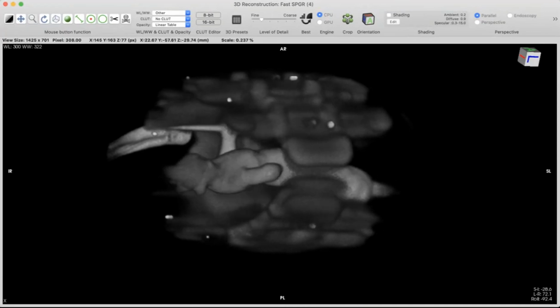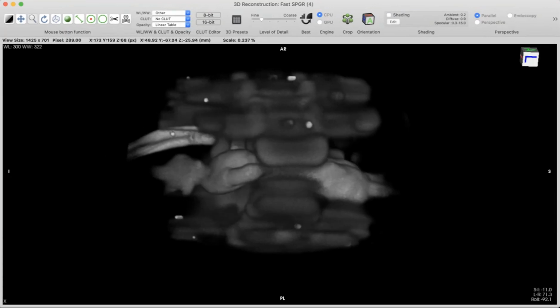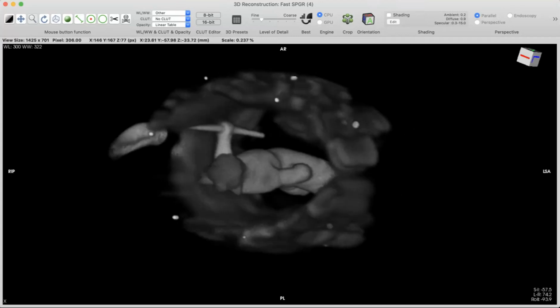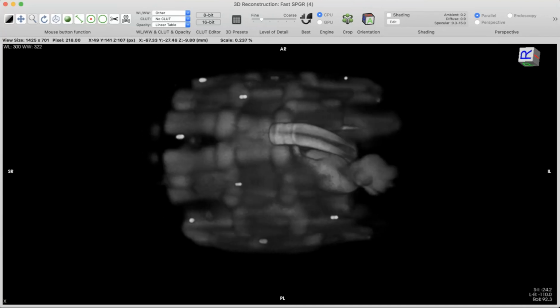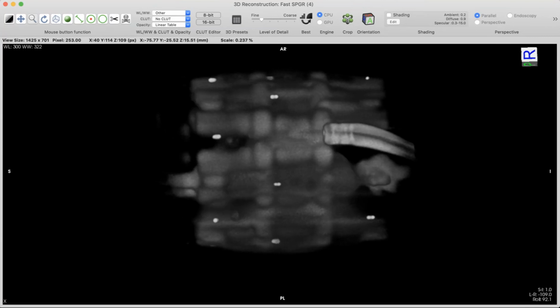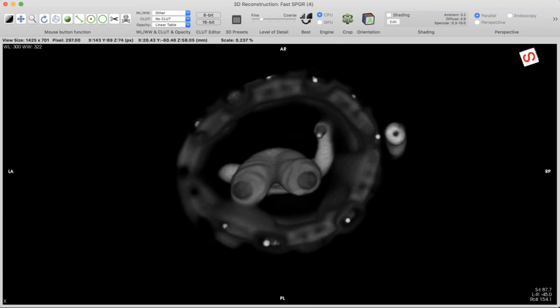So you can see actually the body of Goku sitting inside, but what's around it? Does anybody now have an idea? What is this? The coil and the connector of the coil.